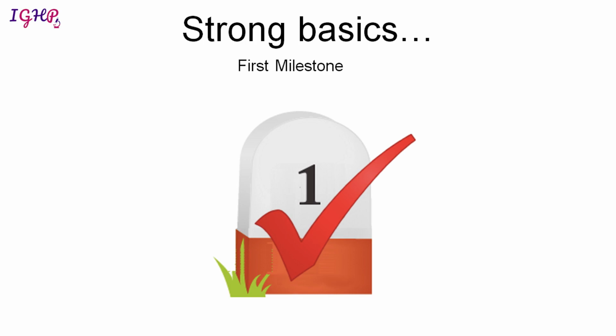This is the second lecture of the basic histopathology, and the main area of focus is going to be the basics of histopathology. This is going to be our first milestone that we'll be achieving in the department. Once we are aware of the various things in the department and how the machinery works, now we are going to look into the slides and we will see certain things that are present on every slide. These are going to be our basics of histopathology, and we'll be seeing these in all slides that we'll be examining. So let us move ahead and achieve our first milestone.